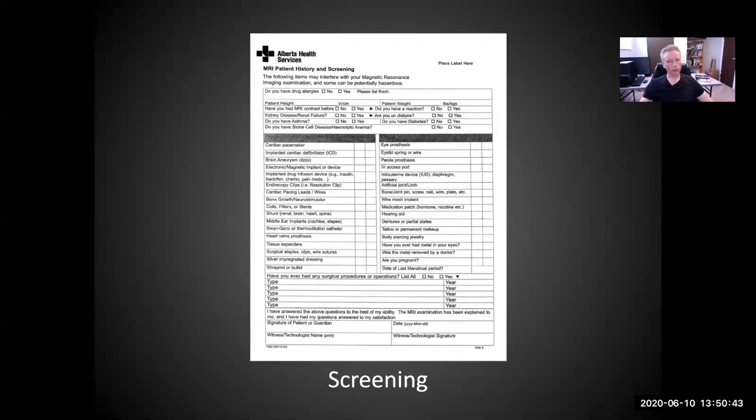When it comes to medication patches, we would always want to have them removed, because a patch such as a nicotine patch, which is extremely common, could leave a burn on the person. So if removed, it's fine for that person to go in, but otherwise not.